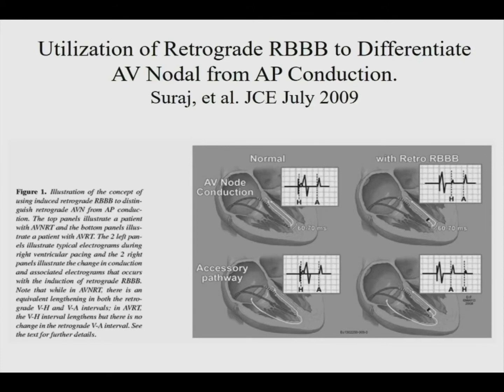Yeah, so I think someone said wobble also. So if there's variations in the cycle length of the tachycardia, which tends to occur at the beginning and at the end, it's not always present, but if it's there, look and try to deduce is the atrial changes happening first, the changes in the AA interval preceding the changes in the His intervals. If they are, that tells you the A's are driving the tachycardia and that it's an atrial tachycardia. The opposite is true if it's an AV nodal dependent rhythm where the His changes are changing before the AA.